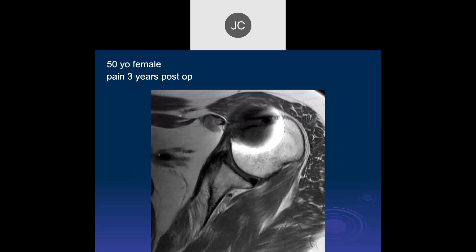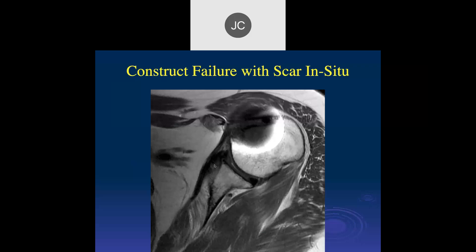A 50-year-old female with pain, three years post-op. There's probably been a subscapularis repair, but the main fibers of the subscap are torn and retracted — the musculotendinous junction is back here — and there's a lot of fatty atrophy of the subscap. This was a failure of the construct, with scar in situ that developed over three years with retraction of the tendon.